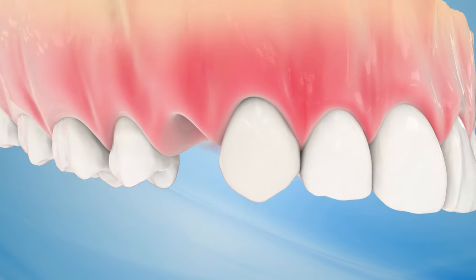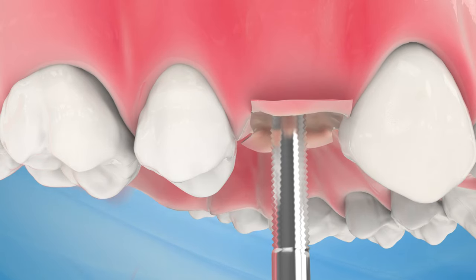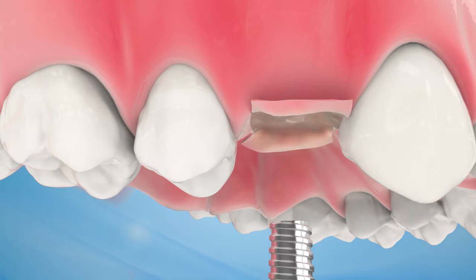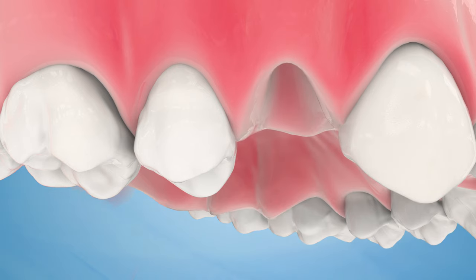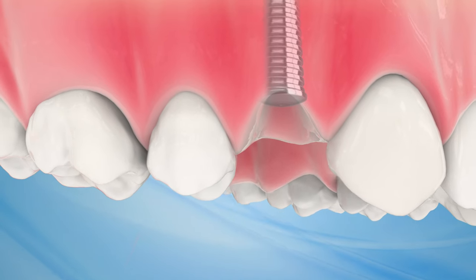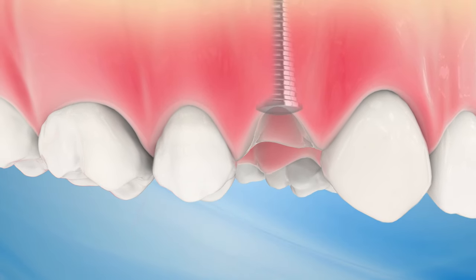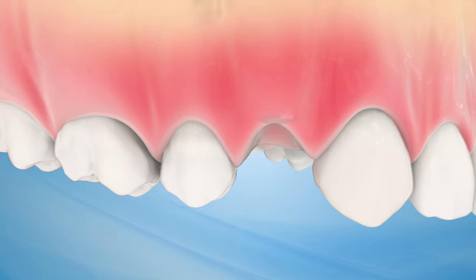First, the implants are surgically placed into the jawbone. Next, the jawbone grows around the implant and holds it in place. It may take several months for the dental implant to become completely integrated before the replacement teeth can be attached to the implant. This timeline is determined by the stability of each patient's implant, bone and gums.